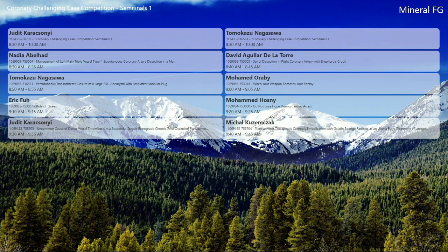No, probably we were not in the true lumen. It was supposed to be in the true lumen because it looked like PDA. But when we passed the deflated balloon, probably we made a bigger hole in the perforation site, so for sure we were outside the arterial bed.